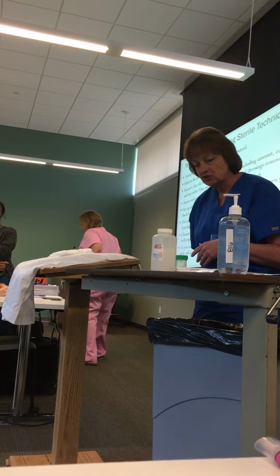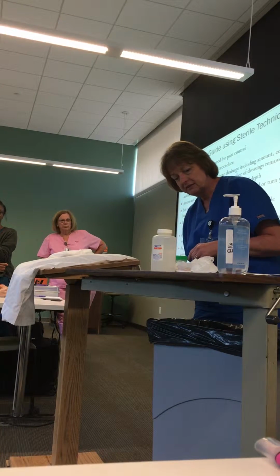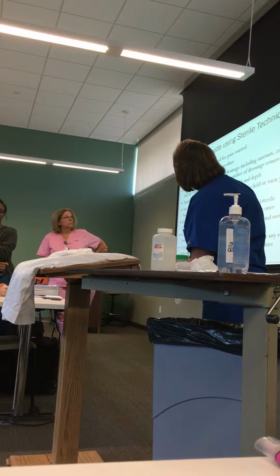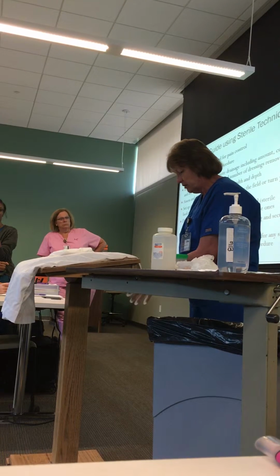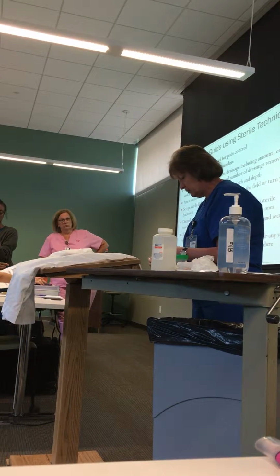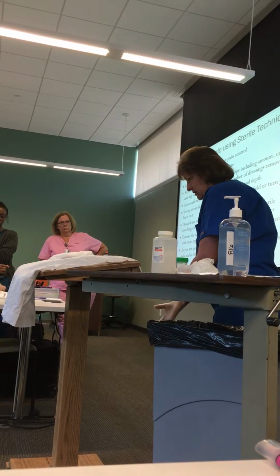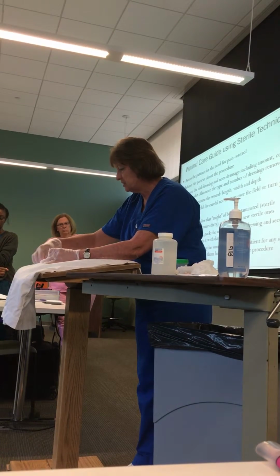So the first thing I have to do is put on my clean gloves, because I've got to take off the old dressing. And then these are in your week this week, so you can follow along with that. I've told her what I'm going to do, and I've already washed my hands, and I'm going to take off the old dressing. So I just want to go around and loosen all the edges if I can.